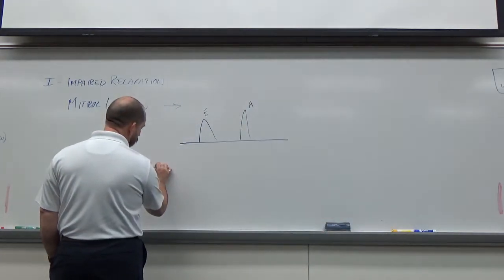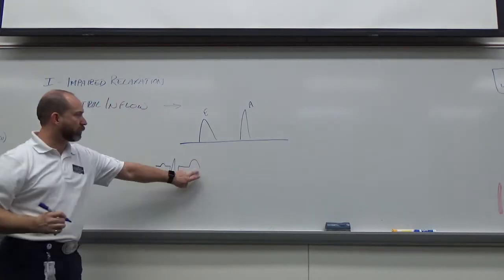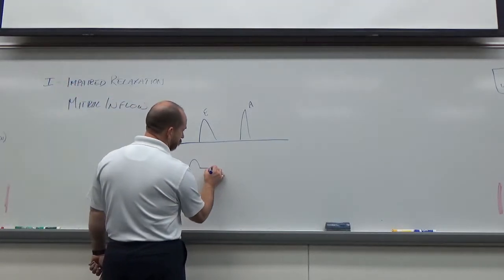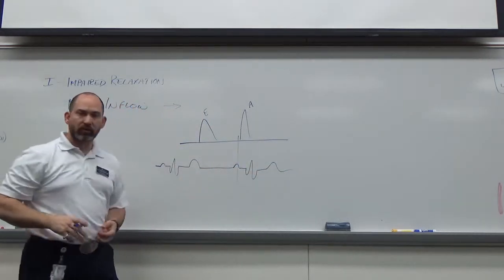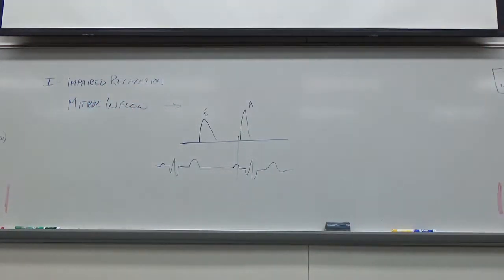So we've got our QRS. Okay, so it should be roughly at the end of the T wave, and then we go into diastole. And the other good locator always is the A wave. So the A is associated with? Good. Okay, so timing-wise, always look at those things. So don't just assume that everybody's normal, even when you're scanning each other, because you will be thrown by it, you'll think, oh yeah, it's normal, and you just measure the highest wave as the E wave, which is incorrect. So make sure that you're getting those correct, and it's just a quick correlation with your EKG.